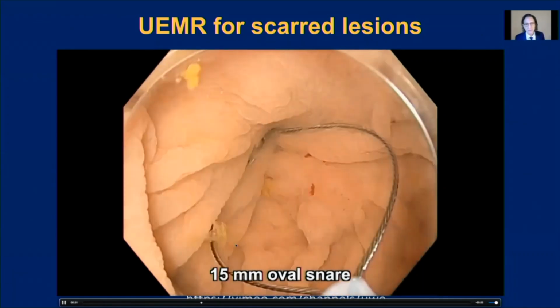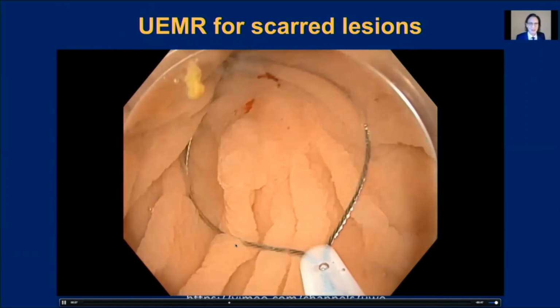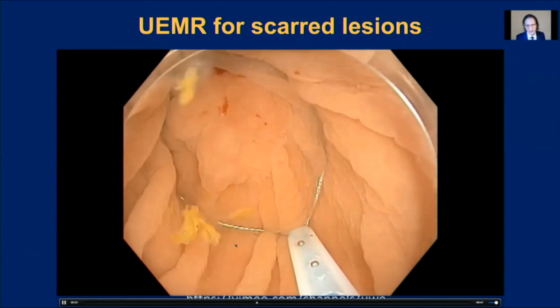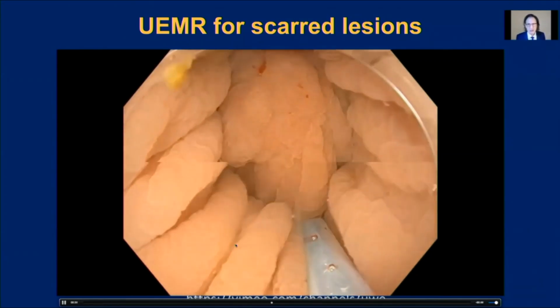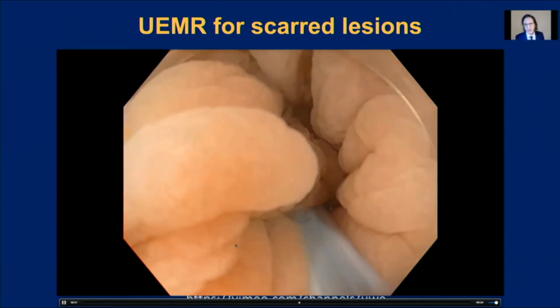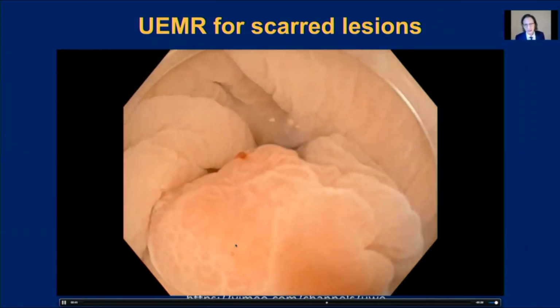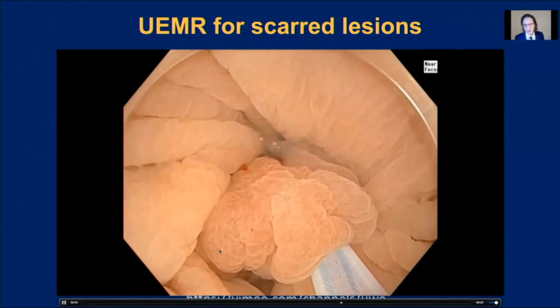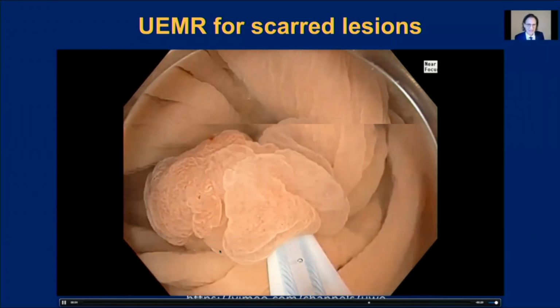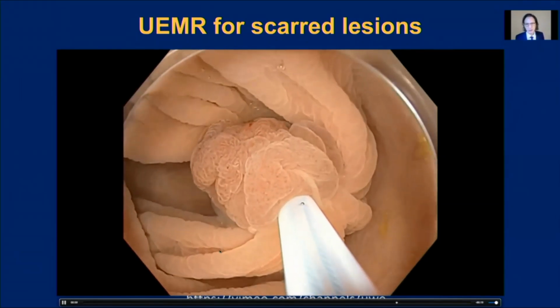So we're opening our 15 millimeter snare now, and we're able to completely encircle the lesion, and we push the snare firmly down. It's a stiff snare, and we allow the lesion to displace up into the snare lumen. We apply some gentle suction, so I call this the water pull, to pull that lesion a little bit more into the snare lumen to maximize our capture, the real estate that we capture. And then we apply our current. It looks like we have the entire lesion encircled with our snare.